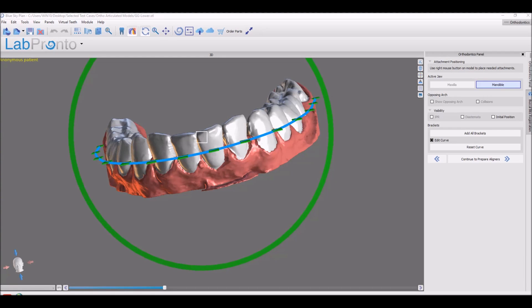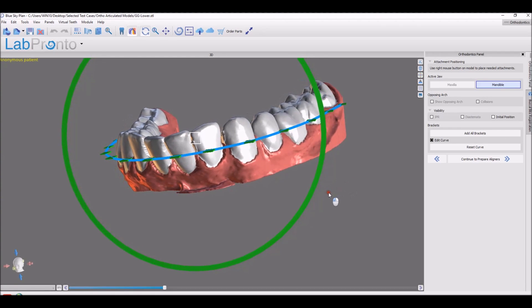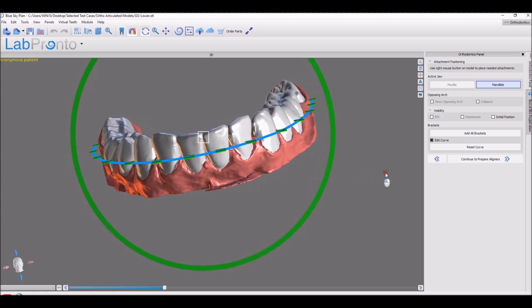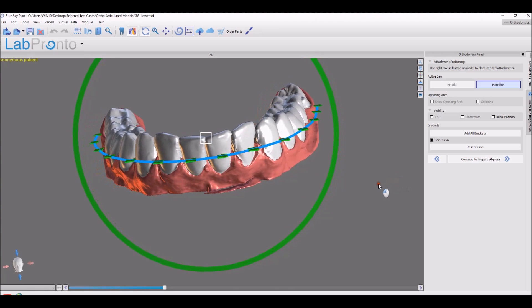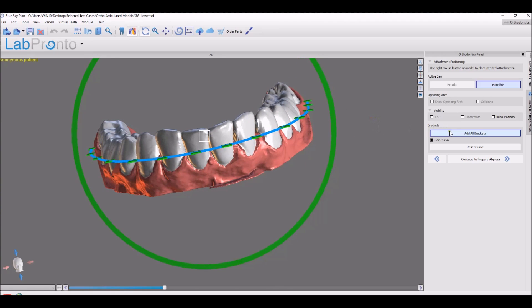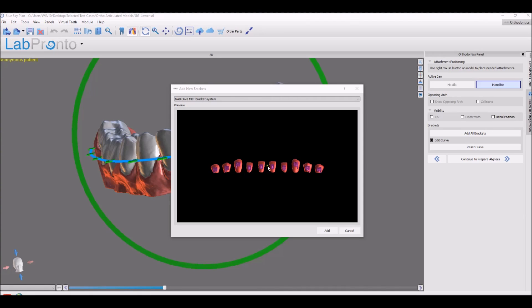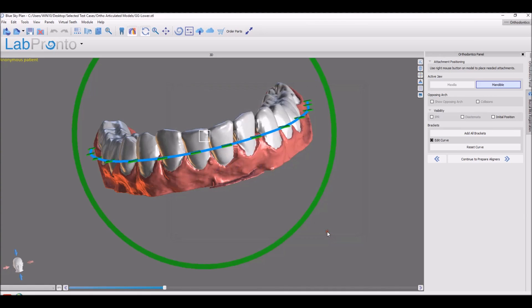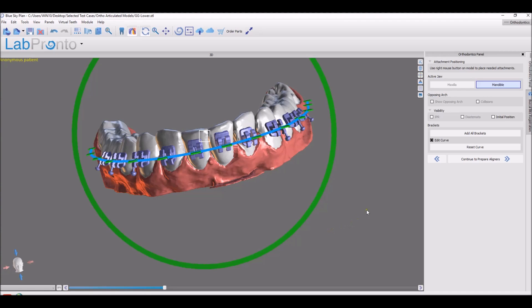Adding brackets is super simple, as the software automatically puts this curve here by default. You could rotate it as needed, but just adding the brackets is add all brackets. You could unselect teeth if you like, but you just click the add button and the brackets are added.